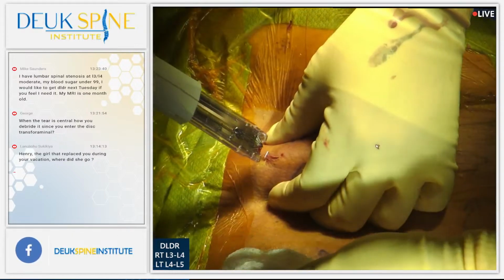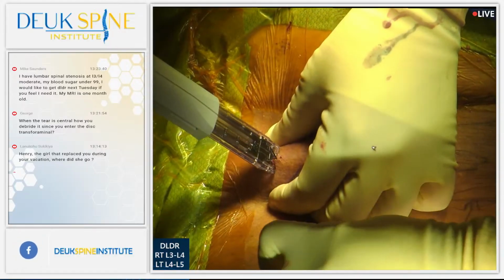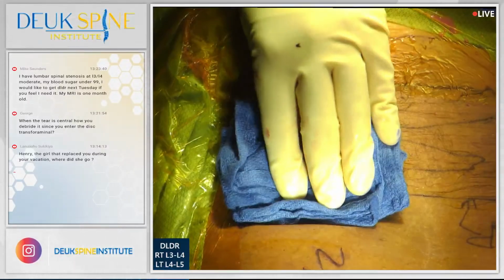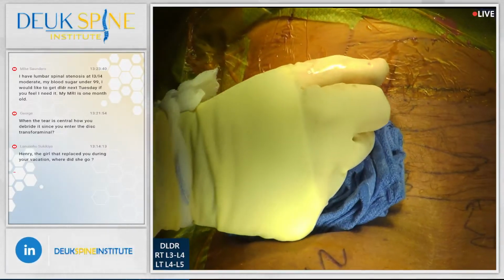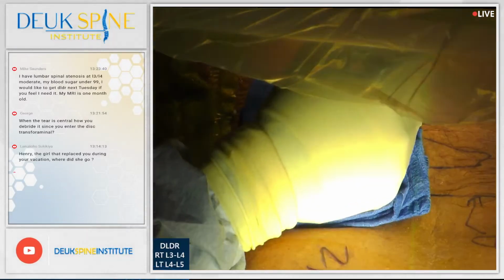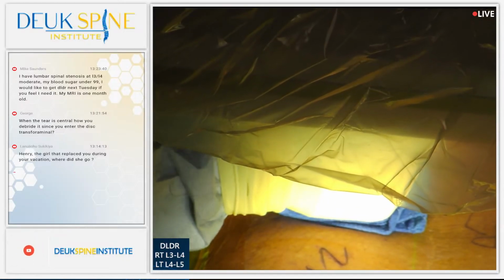And we're going to put these staples in. We'll get them off tomorrow in the morning when the patient comes in for a checkup. And then we're going to switch them out for just a Band-Aid, basically. So that's the right side. I'm going to switch sides with Luis. He's going to come over here. And I'm going to go to the left side and do the L4-5 on the left, because that's where the tear is. At 4-5, it's on the left side. That's the tear causing pain.